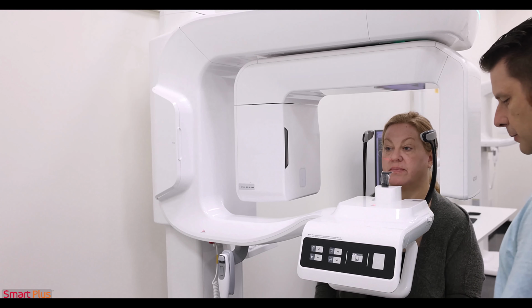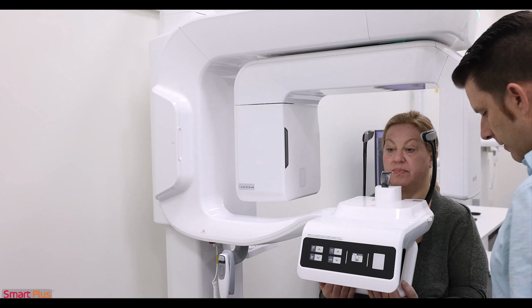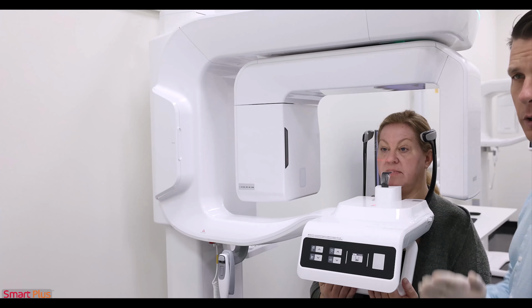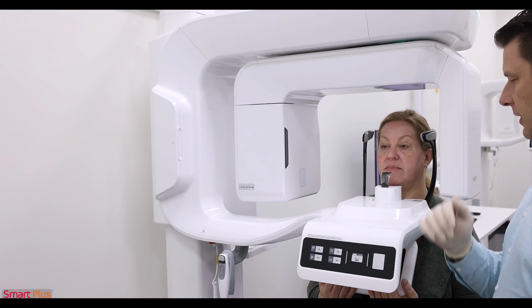And I'm going to step over here and I'm going to have the patient start with your hands. So go ahead and hands, palms facing up. Feet, go ahead and walk forward until your feet hit mine. What we're ensuring is our patient is standing up perfectly straight.